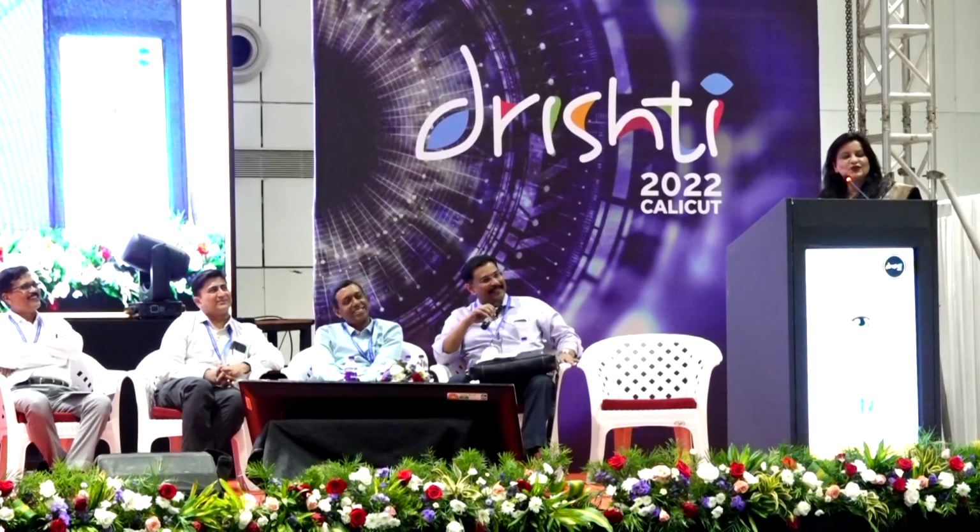And do you have any idea of how much it costs? I know the cost, but the cost is, of course, very high. It is the cost of the operating microscope plus the cost of the OCT combined together. And I'm sure that with time, even our own companies are going to make it, and the cost is going to come down. Thank you, madam. It's nice to see all these unseen things which happen while we are doing surgery. So, thank you very much.